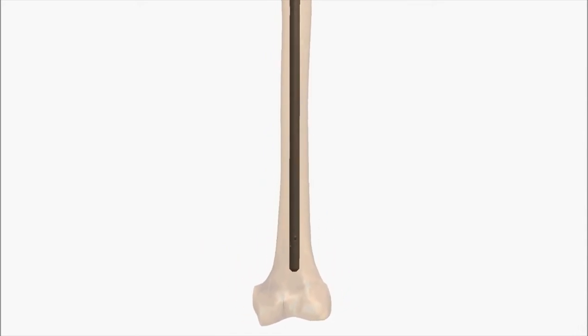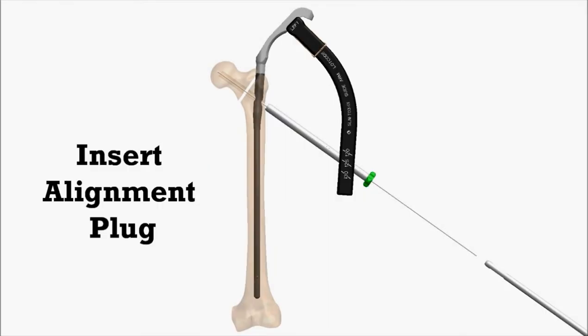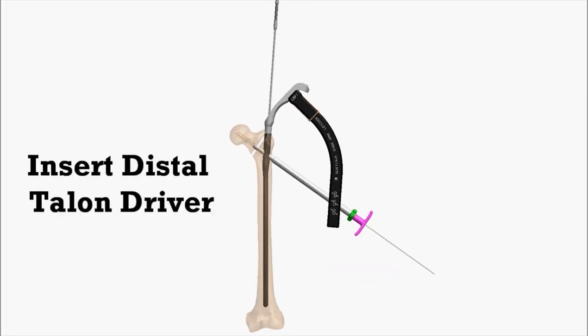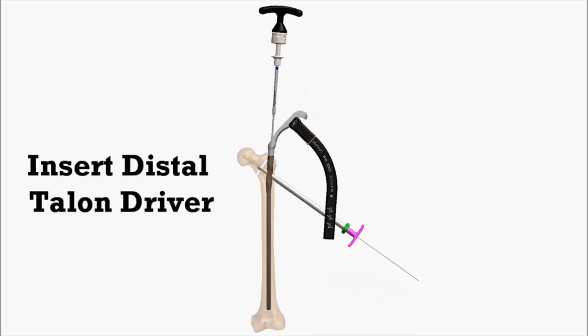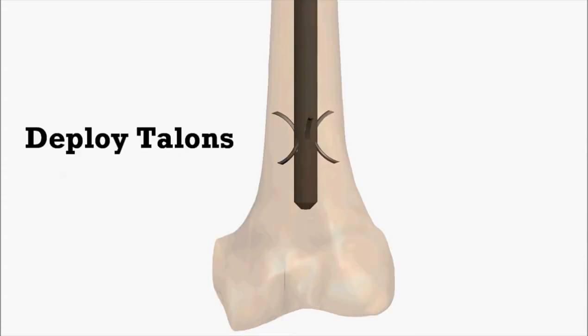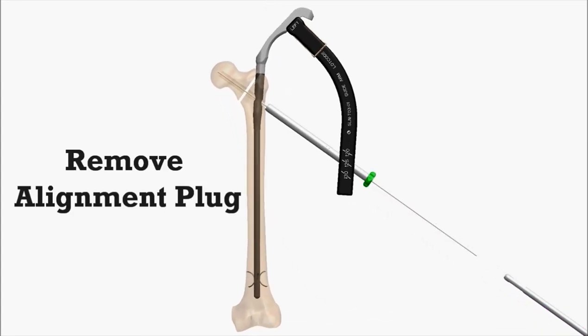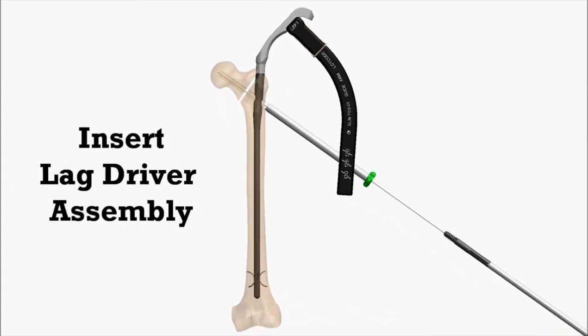Let's take a moment to see the Talon technology in action. Insert the alignment plug to keep proper alignment of the femur while deploying distal talons. Insert the distal talon driver through the nail and turn clockwise to deploy the talons. Remove the alignment plug and insert the lag driver assembly.